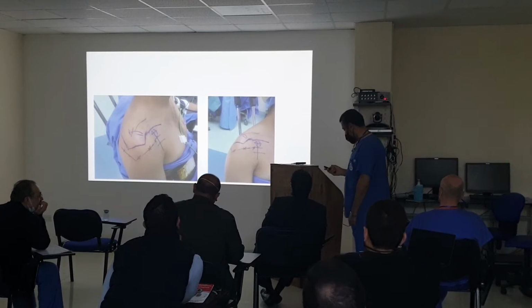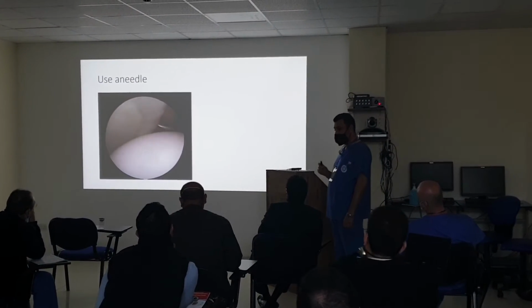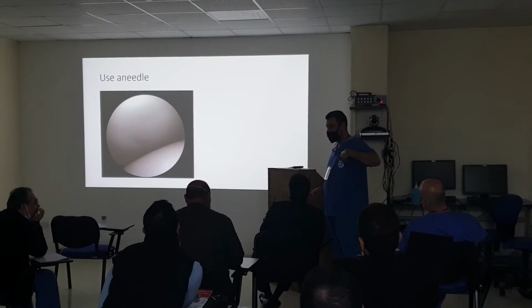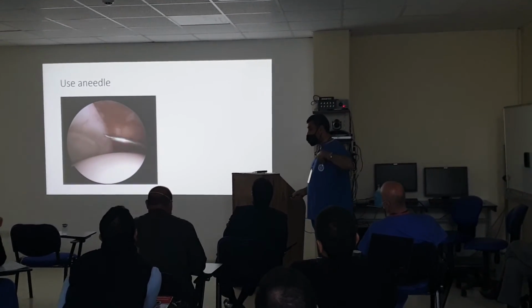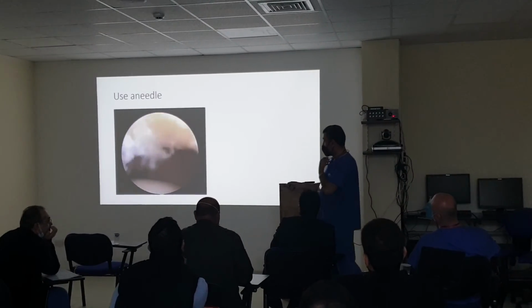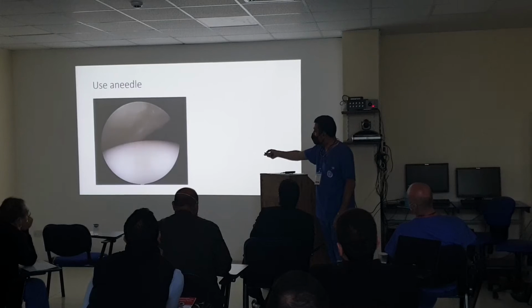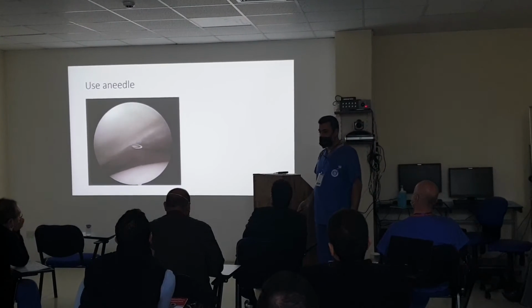Everything will change. Okay. Now, you see, the best when you do the portal is to use a needle. You know? And here in the cadaver course, I bring the needle with me because this is very important. It gives you the guide, the angle, the direction. And look here how many punctures I did, okay, just to reach this. Okay, now I can reach the pathology, so I am satisfied with this portal.